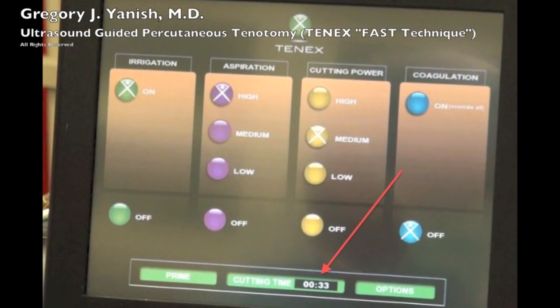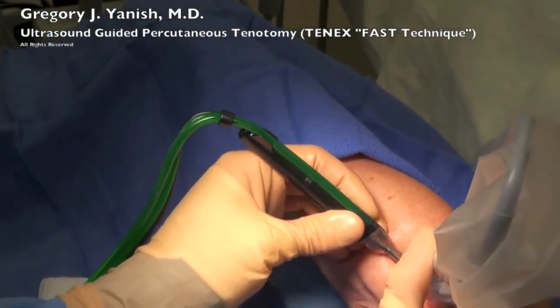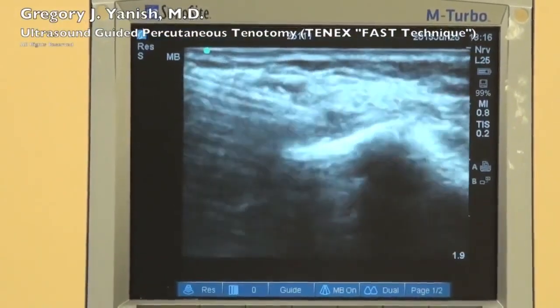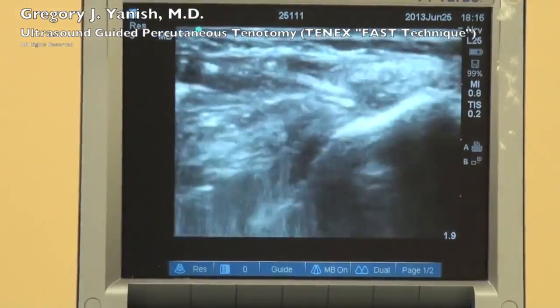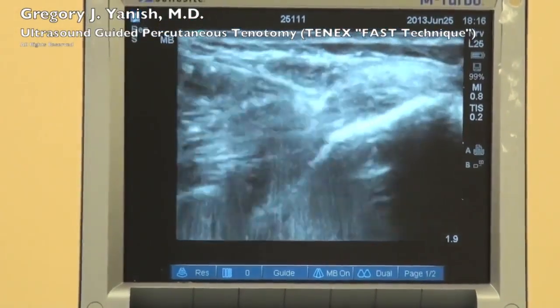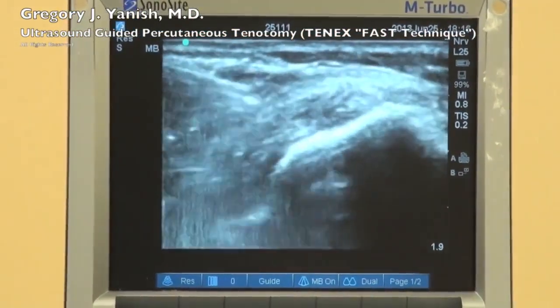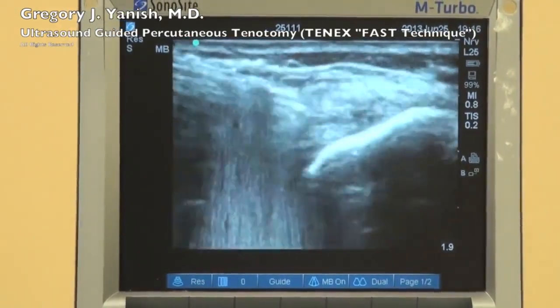Here's the cutting time, and this is the actual time that I've been stepping on the pedal. So far we're up to 33 seconds. Typically we end up using about a minute's worth of cutting time energy. I'm still working away and removing all of that black area, at least as much as possible, that we originally visualized. You can see it's being removed very effectively here.